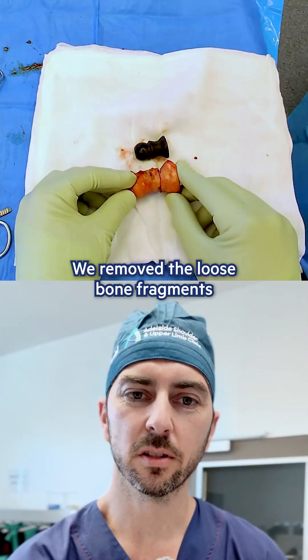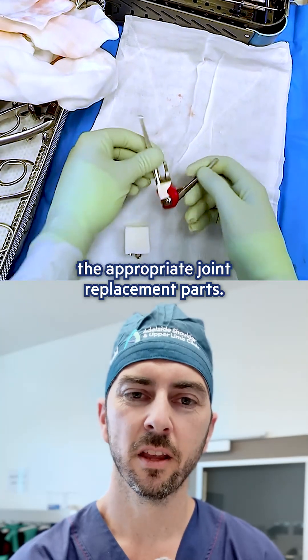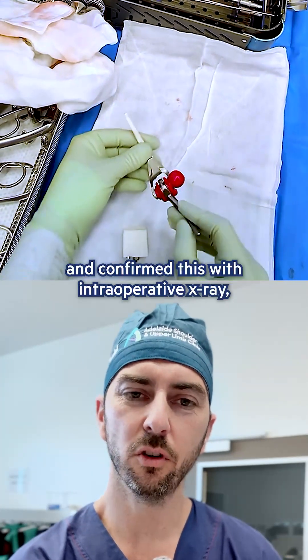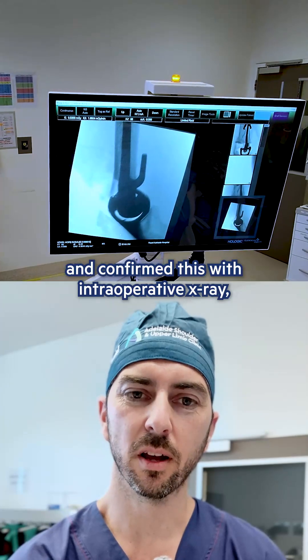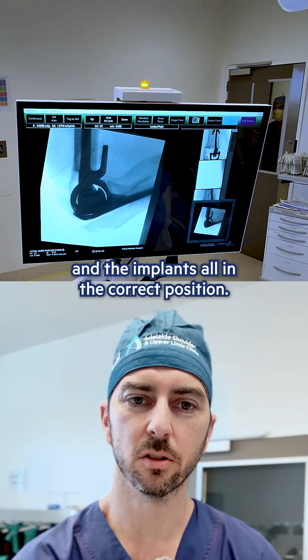We removed the loose bone fragments and used these to help us size the appropriate joint replacement parts. We then used trial implants to make sure we had full range of motion, and confirmed this with an intraoperative X-ray showing full range of motion that was impingement-free, with the implants all in the correct position.